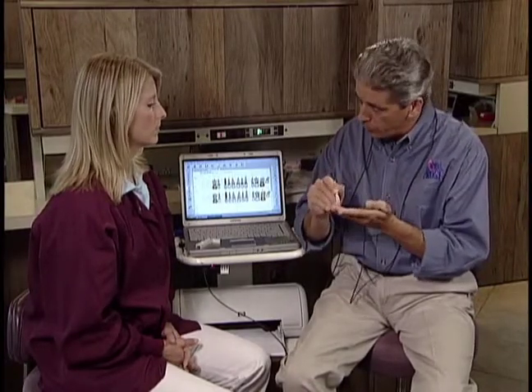Generally speaking, you just stepped before you were in contact with the margin. Secondly, you're probing an involved patient and you get too shallow, even a 0 will annunciate. Undo, use your blue button, make sure you're at the true bottom of the defect, then take your measurement.